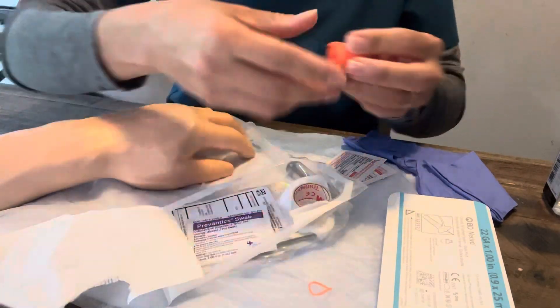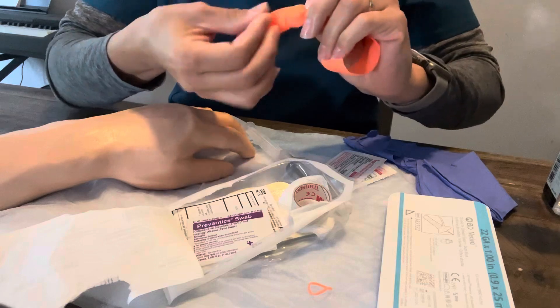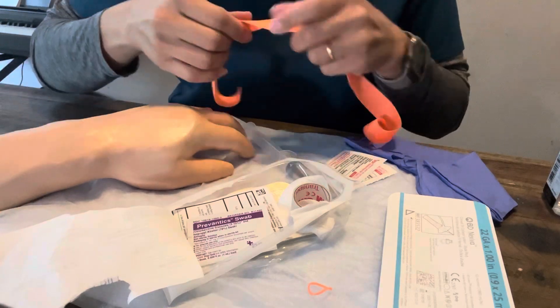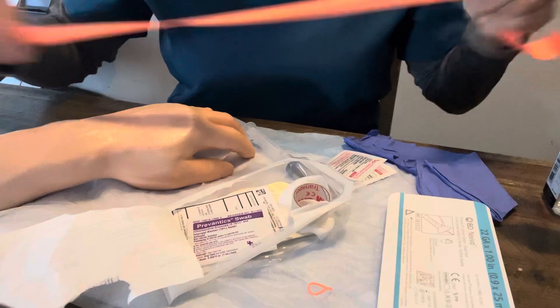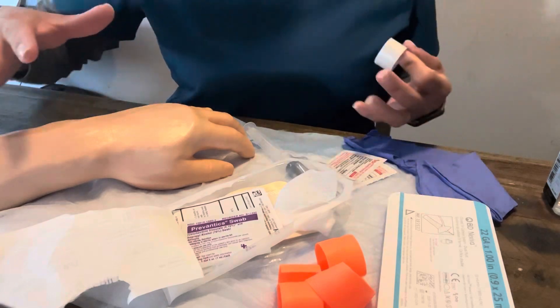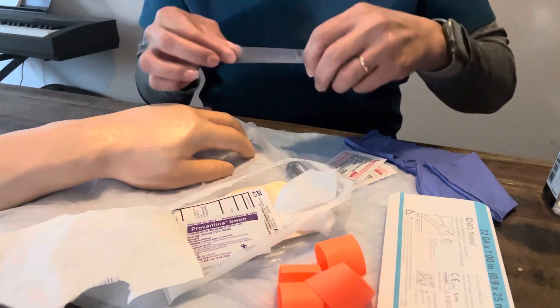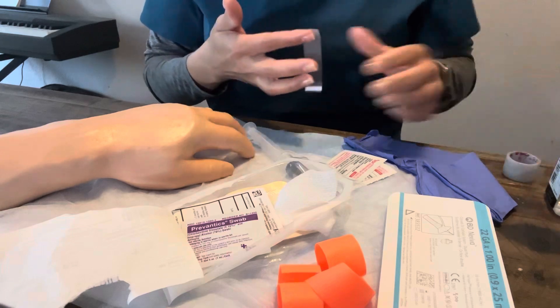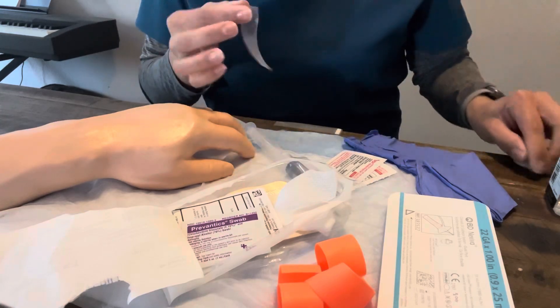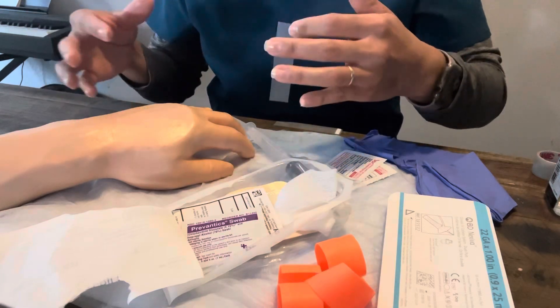What I like to do with the tourniquet — because they're really tight — is stretch it out a little bit, like a rubber band, so it's ready to go tight on our patient to help the veins pop up. I also like to get a piece of tape and use the first piece as a barrier to keep it clean. I prefer tape because it helps me anchor down my wings once the IV is inserted so I'm not fumbling trying to grab other things.